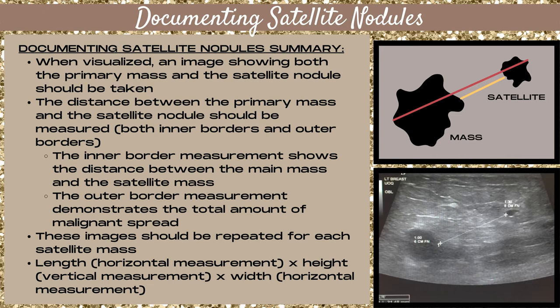The inner border measurement shows the distance between the primary mass and the satellite mass, and the outer border measurement demonstrates the total amount of malignant spread within the tissue between those two areas. These images should be repeated for each satellite mass. If there are many satellite masses, generally pick the three that are the furthest away from your primary mass.